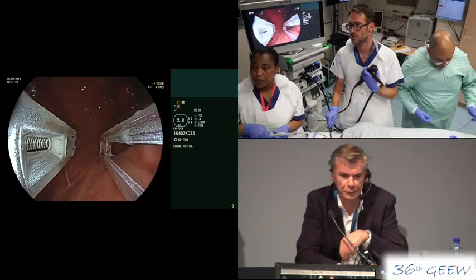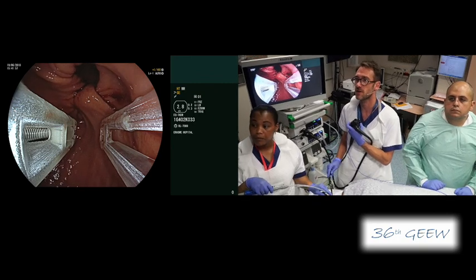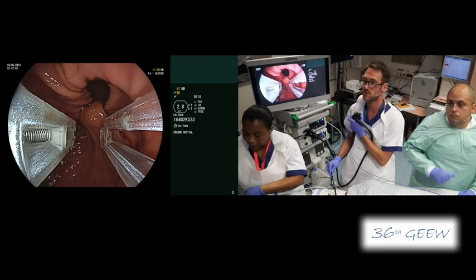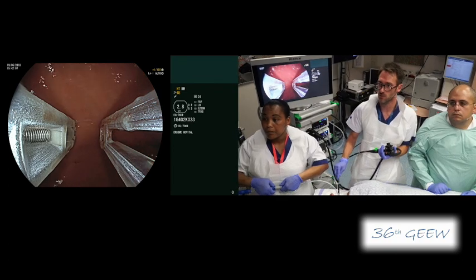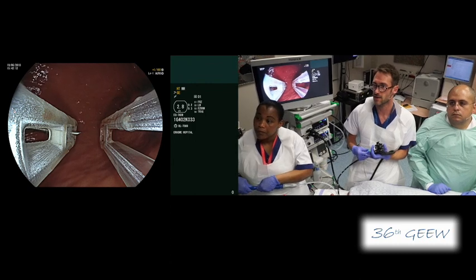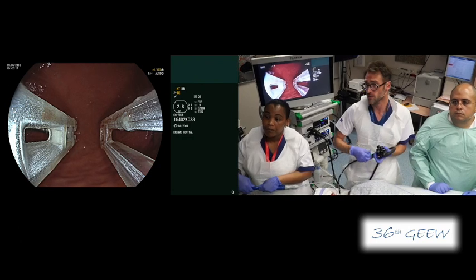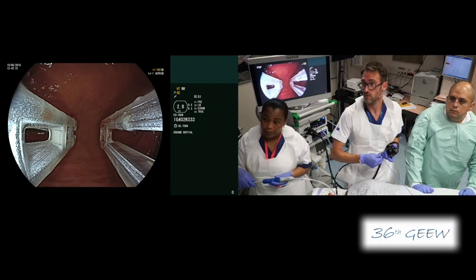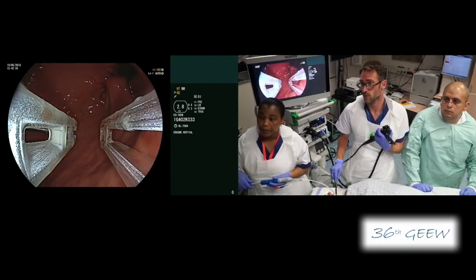Just to show you — we've put two sutures at the size of the incisura and you can see the narrowing of the incisura. Now I'm coming from the incisura to the fundus, leaving the fundus untouched. You can see nicely the needle going through the small window on the opposite side. I will grasp the tissue and do it again. Usually we are putting an average of ten sutures — from eight to twelve — in one to one-and-a-half hours.